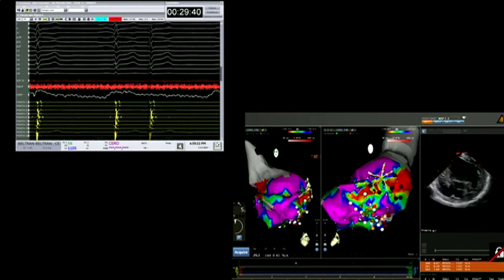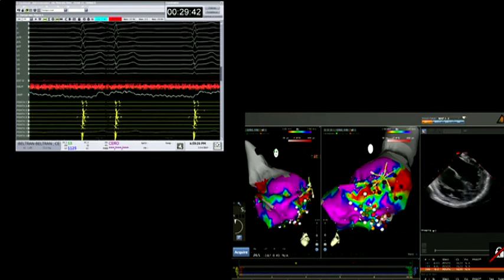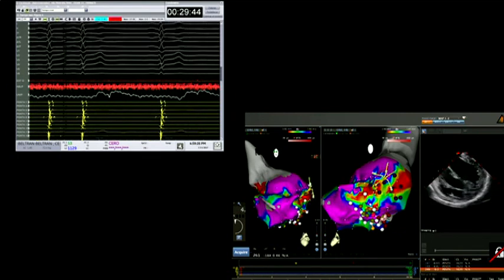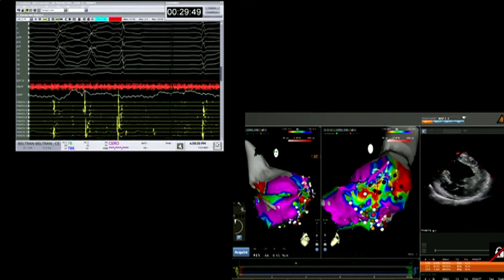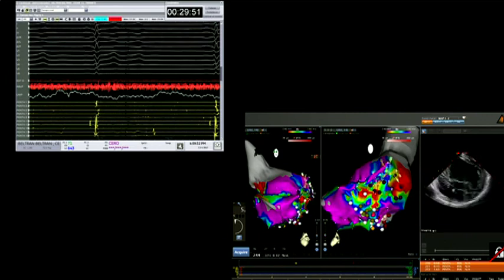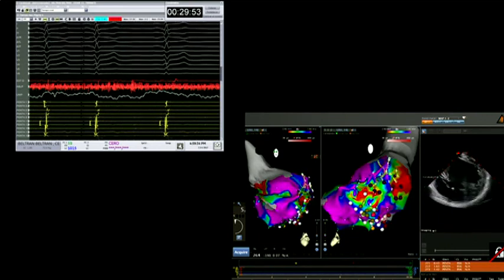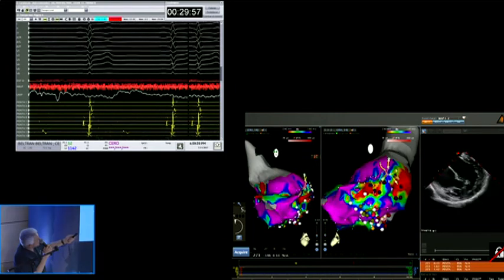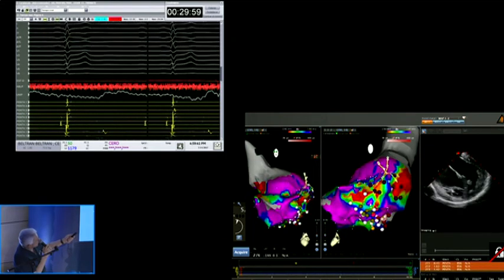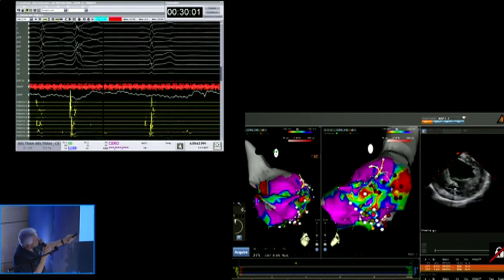Those are not normal, obviously. Those are very abnormal, yes. Look at this. See how delayed, look at the QRS. See how delayed they are. Those are all abnormal. The question I have is for you, Andrea, and for other operators. Look at this. Even this area. Look at this area, Miguel. Yeah. This is all Purkinje maybe? No. This is all delayed potential. This is very delayed.